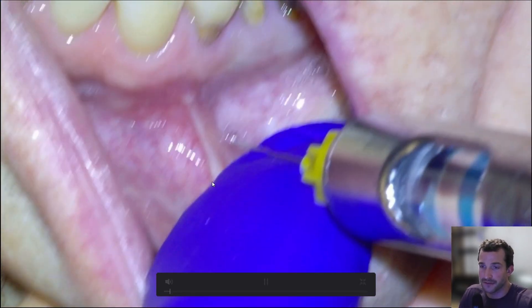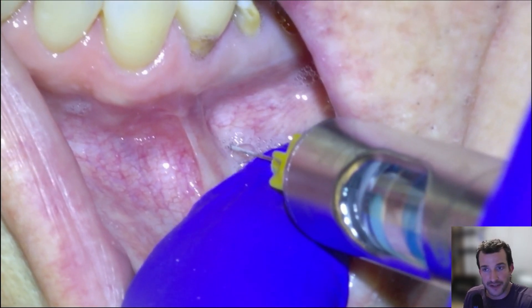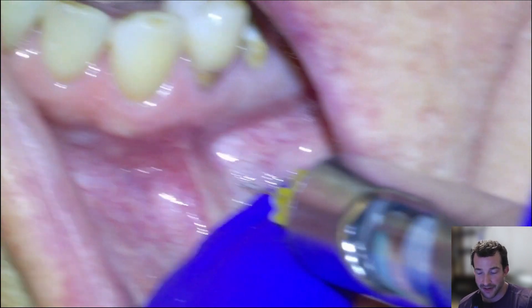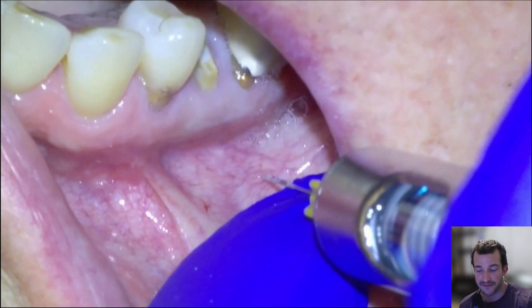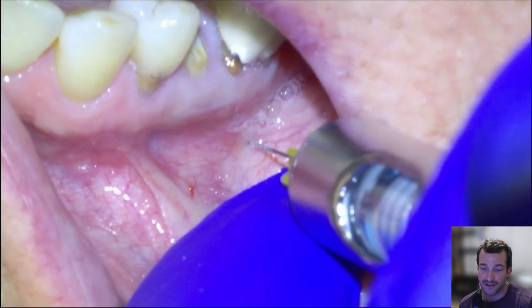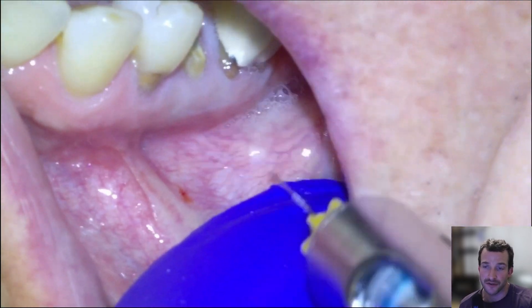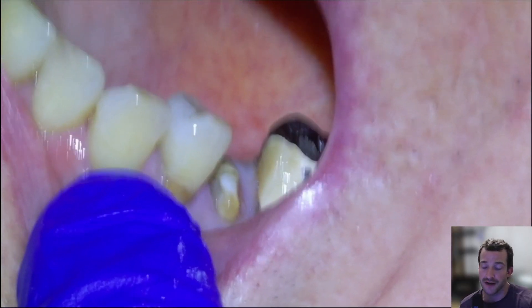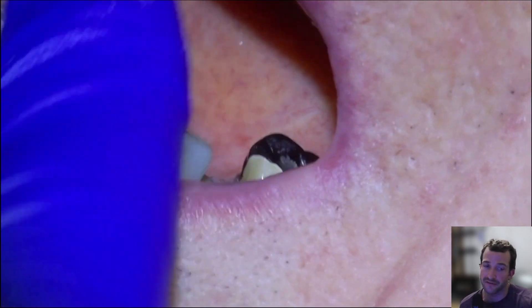We're going to freeze both sides with 1 in 200 articaine preoperatively. We're going to give him 2 grams of amoxicillin, 600 milligrams of Advil, and 1,000 milligrams of Tylenol. 2 grams of amoxicillin has been very clearly shown to increase the integration rate of dental implants, and the Advil and Tylenol are just for post-operative pain management.